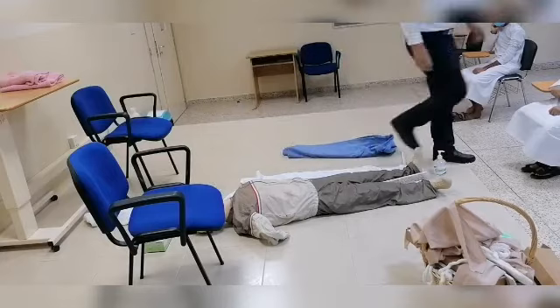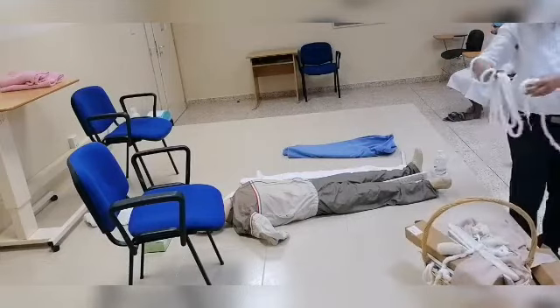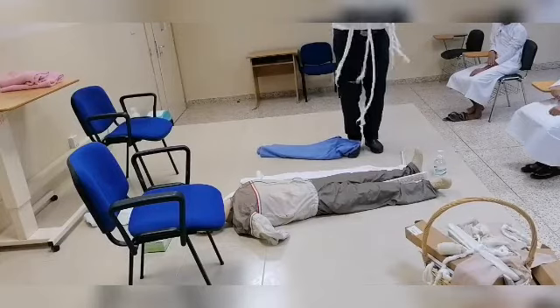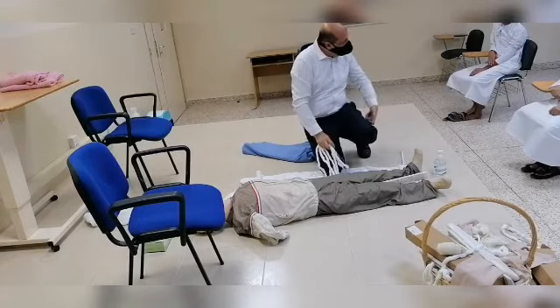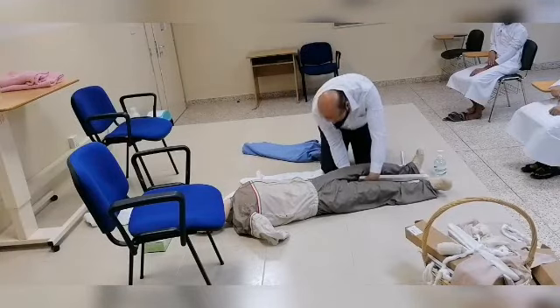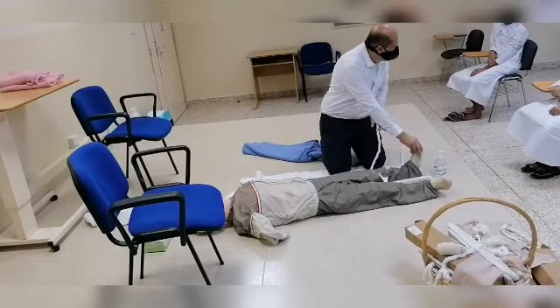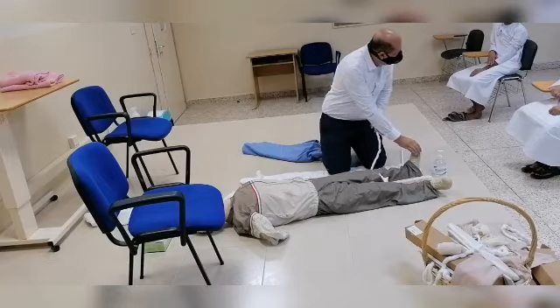Then I will use binders. You know that underneath the knee joint there is a space, so from that part I can enter them. Then I have to adjust them in their places. The longest one should be toward the feet — because we will use a figure-of-eight to fix the feet.